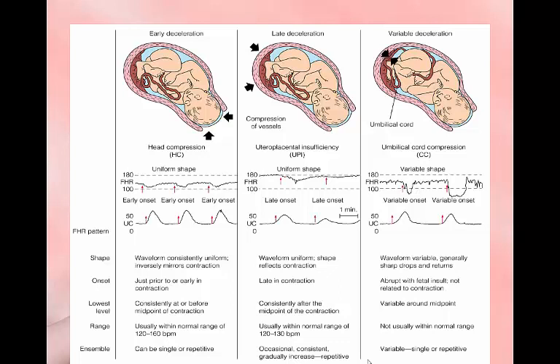We have accelerations, or we have that moderate or average long-term variability that we talked about before. So usually it's something we continue to assess. Now, if they're starting to become repetitive with every contraction and they're getting deeper and they're lasting for longer periods of time, then they could potentially be something a little more worrisome.